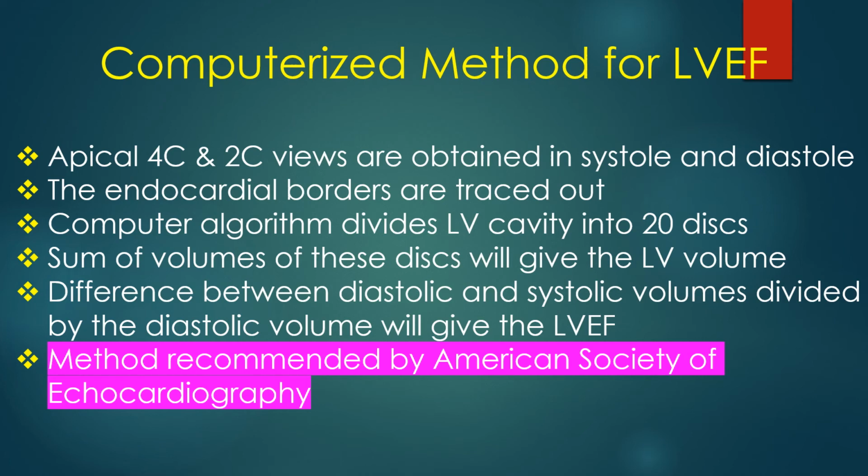Difference between the diastolic and systolic volumes divided by the diastolic volume will give the left ventricular ejection fraction. This is the method recommended by American Society of Echocardiography.